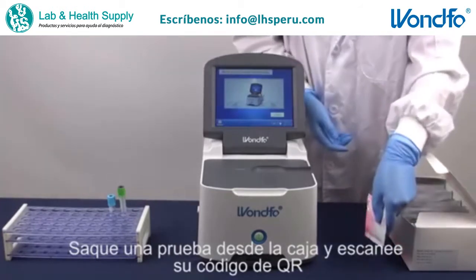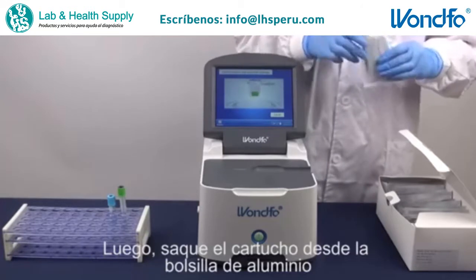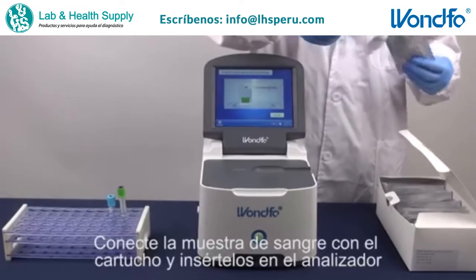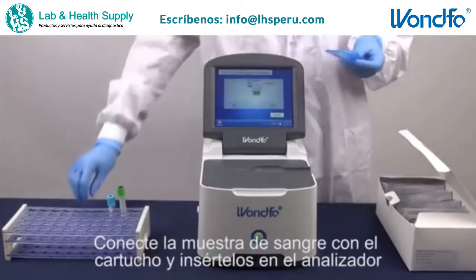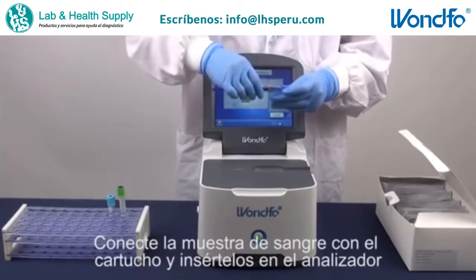Take one test out of the box and scan its QR code. Then, take out the cartridge from the aluminum foil bag. Connect the blood sample to be detected with the cartridge and insert them into the analyzer.